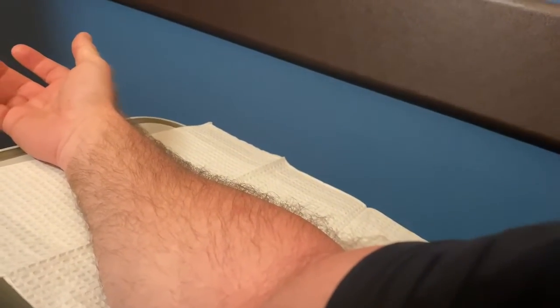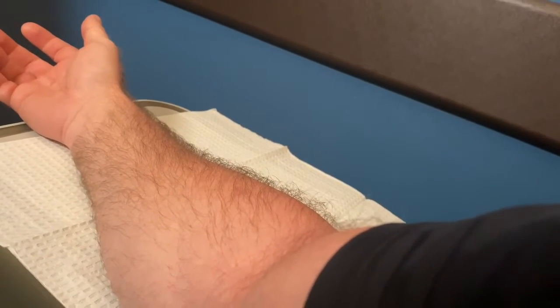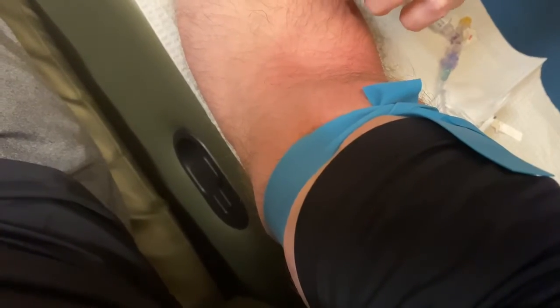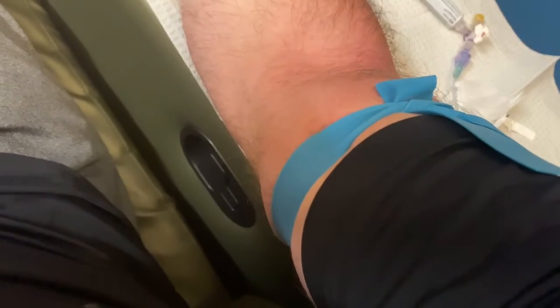I've had a lot of people ask me what happens when you do a scan. I know there are videos, curiosity and things, but it's pretty standard, like drawing blood. There are just a couple of different hiccups in the process. Usually they go through my port, but today we're going to go through my arm because I've had really good veins lately.